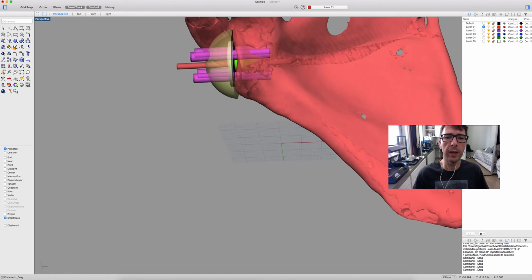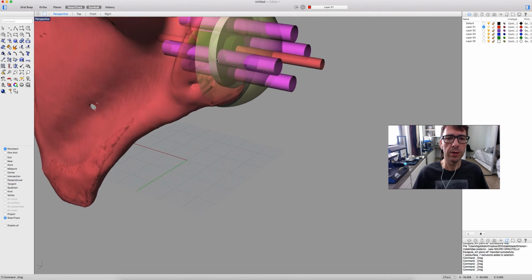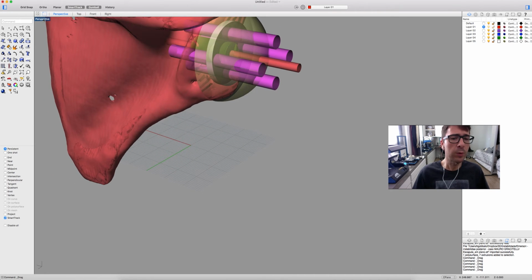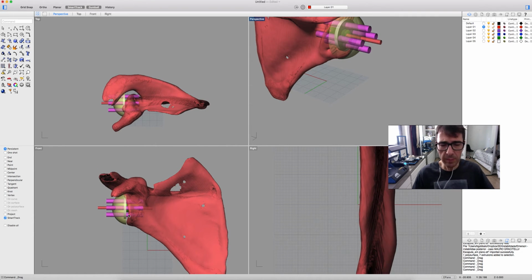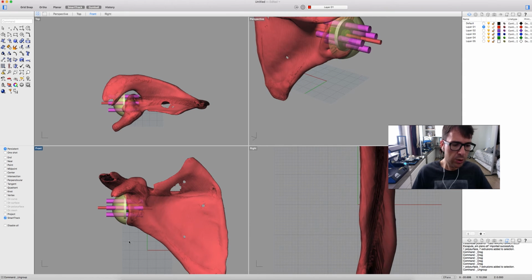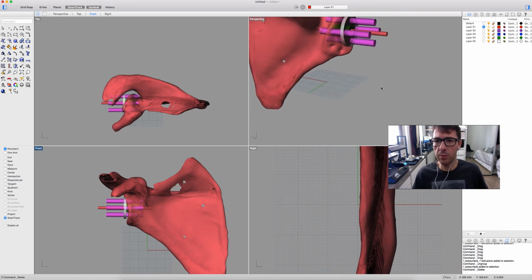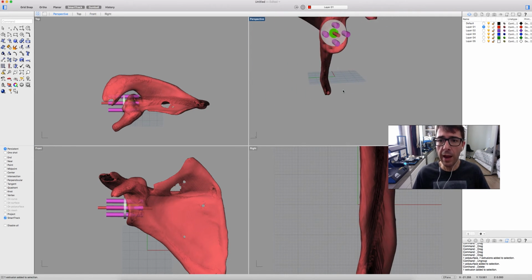planned. Okay, so here we have the scapula, the location of the screws, the pin guide, and we're going to create a very easy patient-specific guide. Okay, let's assume that this is the location we want. So we're going to delete the glenosphere. Let's assume this is the location we want. We are going to delete everything else.